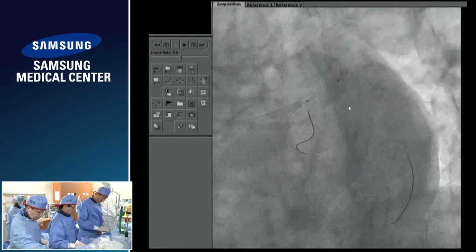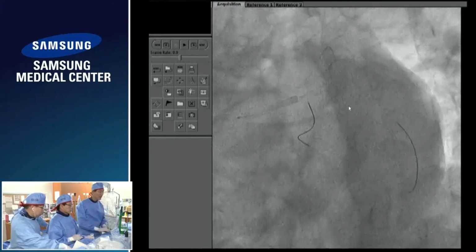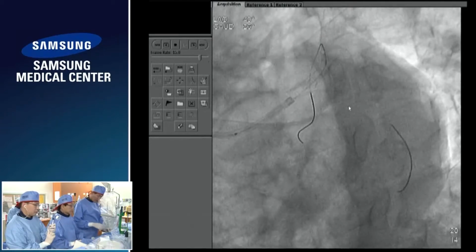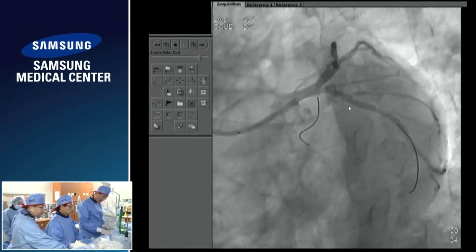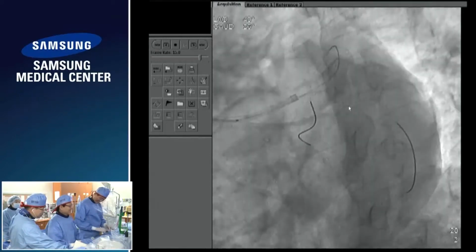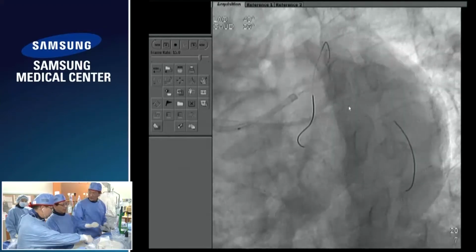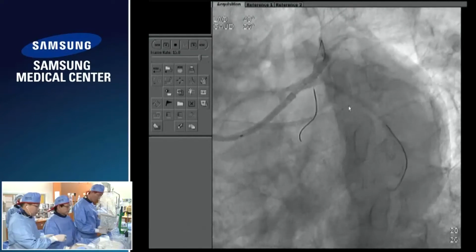And angiogram first. Maybe you can do part before stenting. Okay? Angiogram. Sure. Maybe there is some argument about whether we have to stent the circumflex or not. But anyway, we found in IVUS, I didn't show the IVUS for circumflex. So anyway, this disease length is about 5 millimeter.